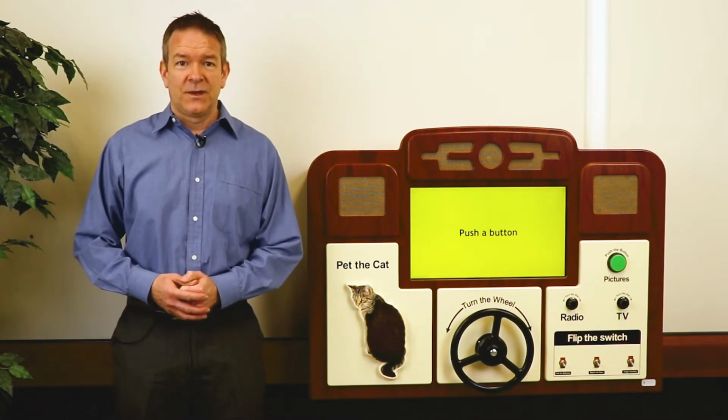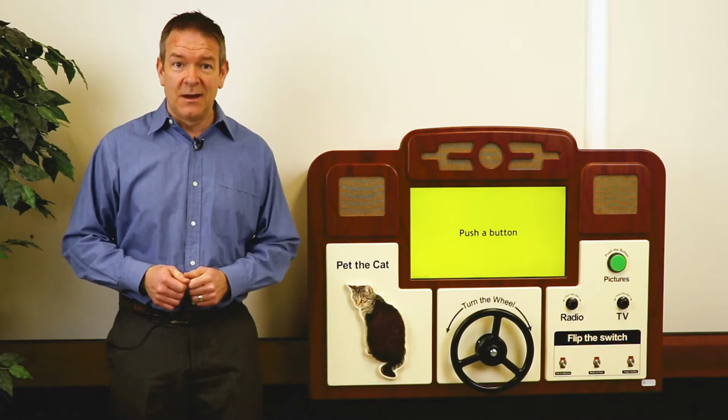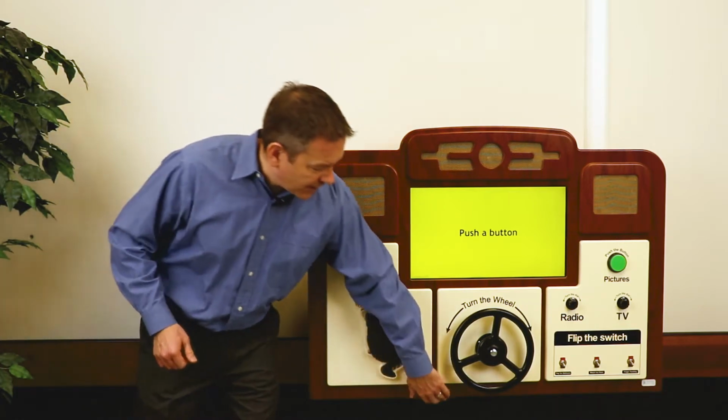Step 1. To avoid the risk of electrical shock, let's first turn off the unit. The off-on switch resides on the bottom of the Abbey.